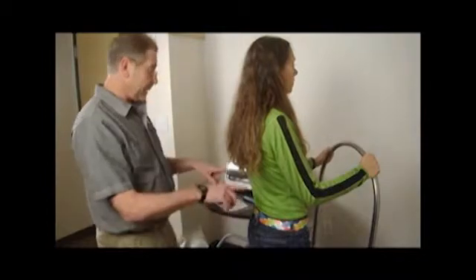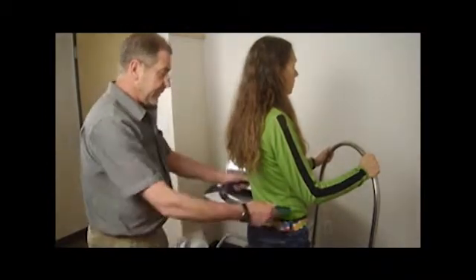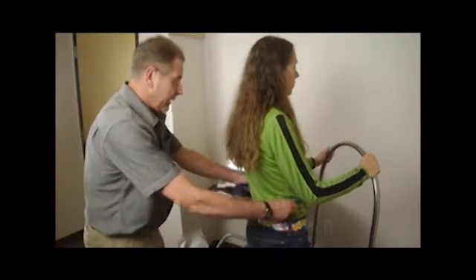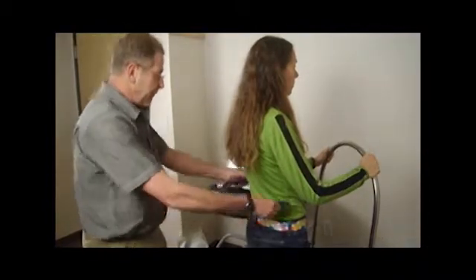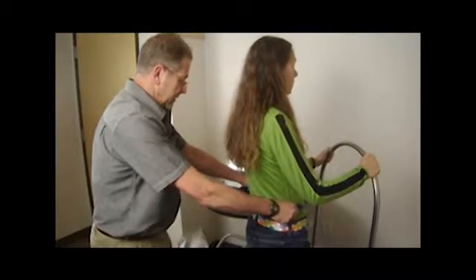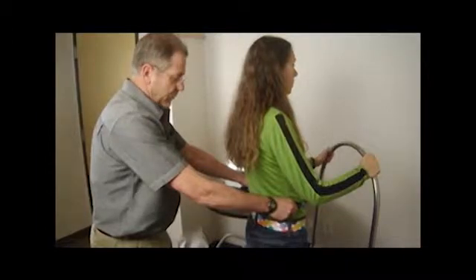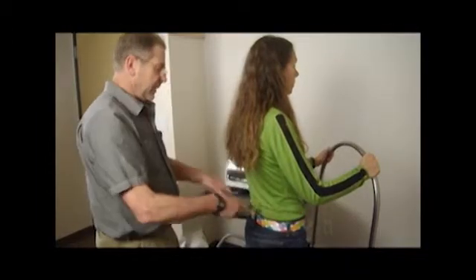Okay. So the last thing I need to do is check the pelvic plane to see if there's any leg length discrepancy. This is just kind of a cursory evaluation. Take the pelvic level, place it on the crest of the pelvis, and left hip is slightly elevated. I'm going to guess maybe a quarter to 3/8. Nothing I'm going to really concern myself with at this time.